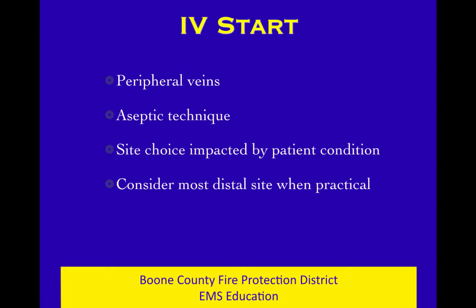We'll talk about aseptic technique over and over again. The idea is that we should not be introducing any additional infection risks to our patients. We'll talk about site choice and how you decide where to start your IV, and that's usually based on how sick the patient is and what sort of choices you get.